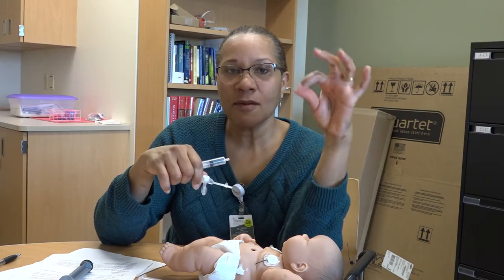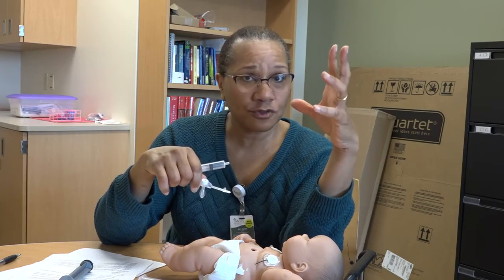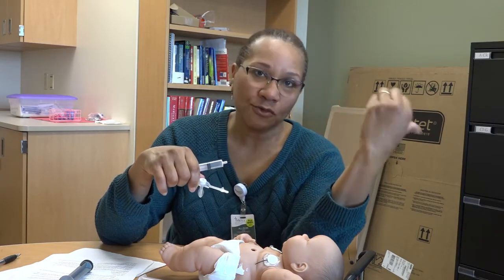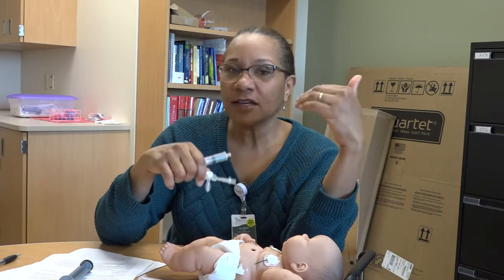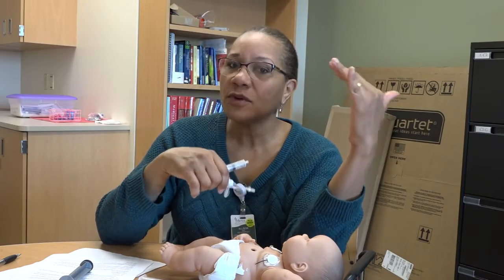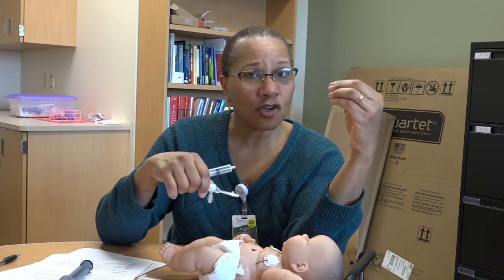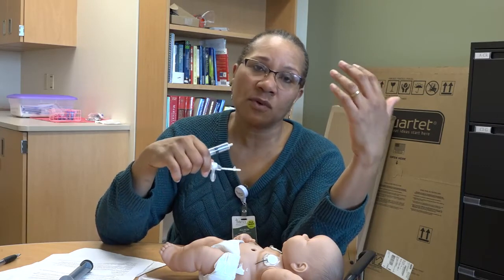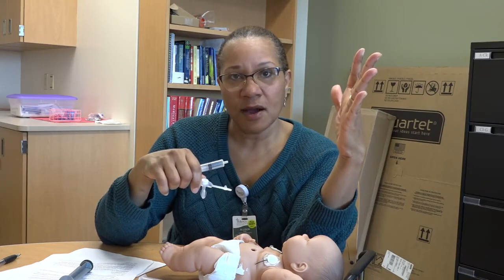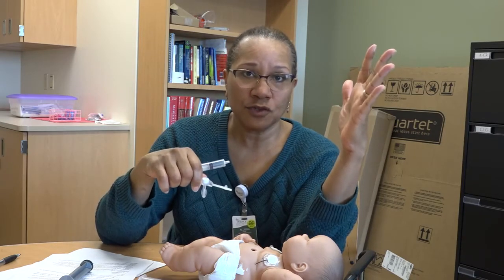First of all, if there's any problems with your G-tube in the first 3 months after having the G-tube surgery, and we haven't performed the first G-tube change, which happens 3 months after surgery, if anything is going on with the G-tube that you are concerned about in that time frame, those first 3 months, we really do want you to call the office, because we want to be really hands-on with that G-tube in those first 3 months while we're waiting for that tract to mature, okay? So these volume checks that I'm talking about isn't anything that you're going to be doing within those first 3 months of having a new tube.